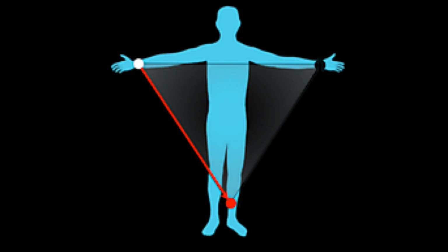Let's talk about limb lead reversal itself. In order to understand that, you kind of got to know how an EKG gets born. So you essentially have three leads. You have one that's labeled RA, one that's labeled LA, and one that's labeled LL. When I say leads, I mean those are three electrodes that you have hooked up to a computer box that does some magic with electricity and figures out the current running between those things.